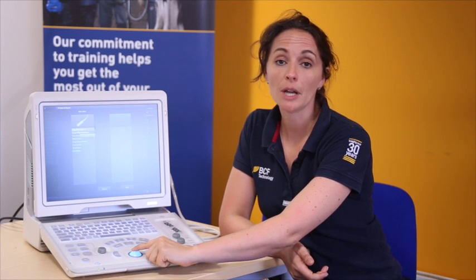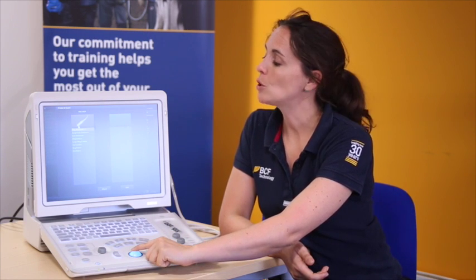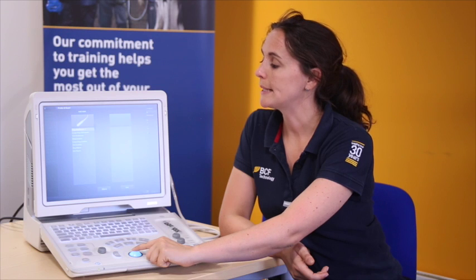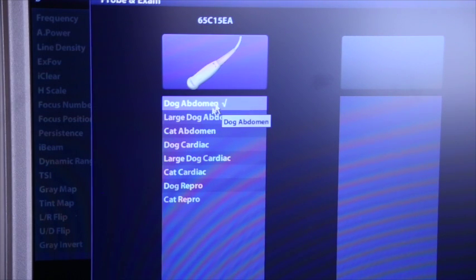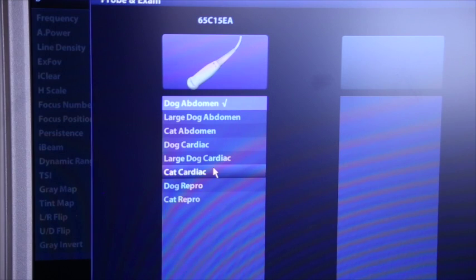For demonstration purposes, I'm going to choose the dog abdomen preset. However, if you are doing a cardiac exam or a pregnancy scan, we have the right kind of presets to go with it.